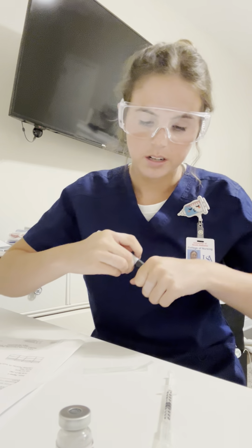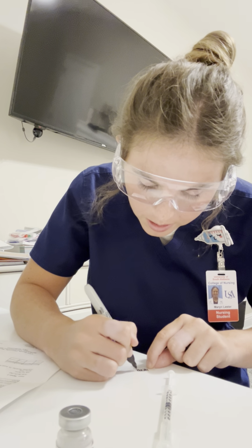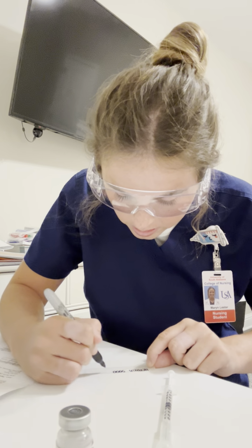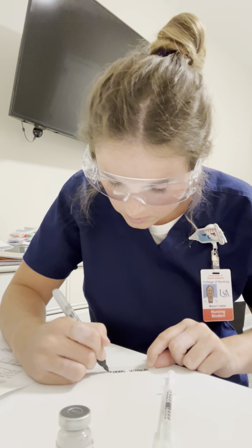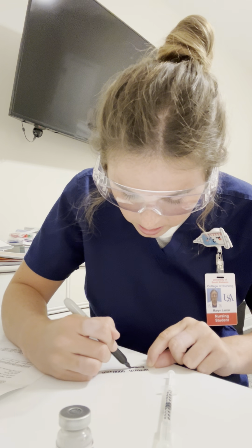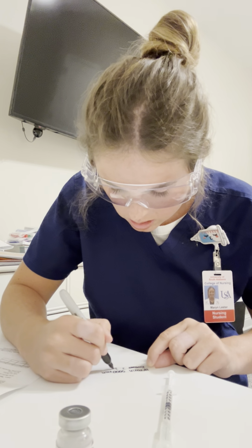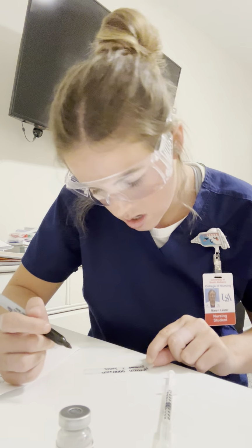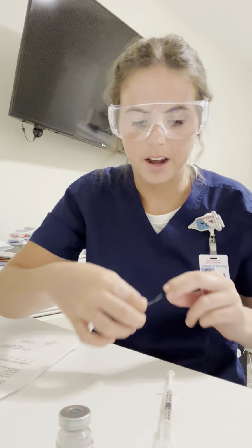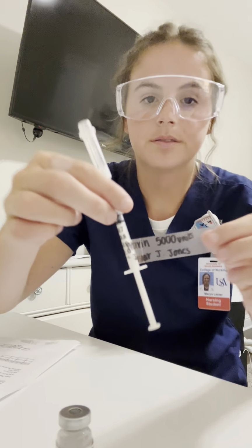So I'm going to put heparin, 5,000 units, Jaguar J. Jones. Okay. So now I'm going to put that on the end, and now we have our label made.